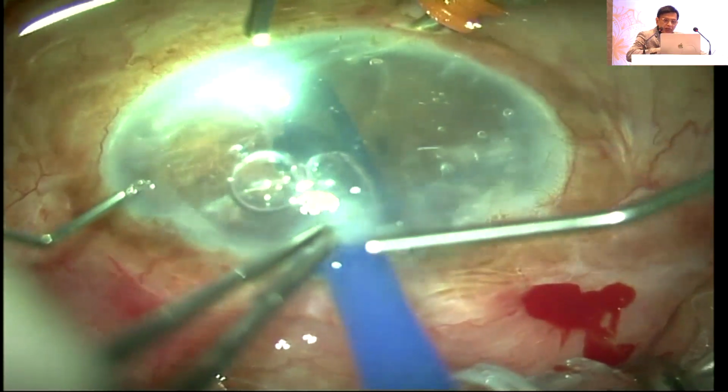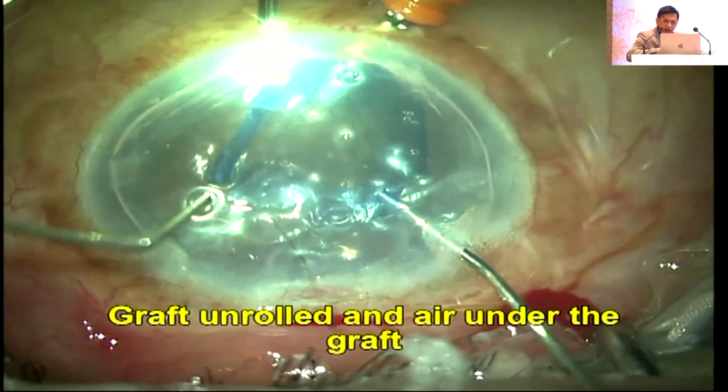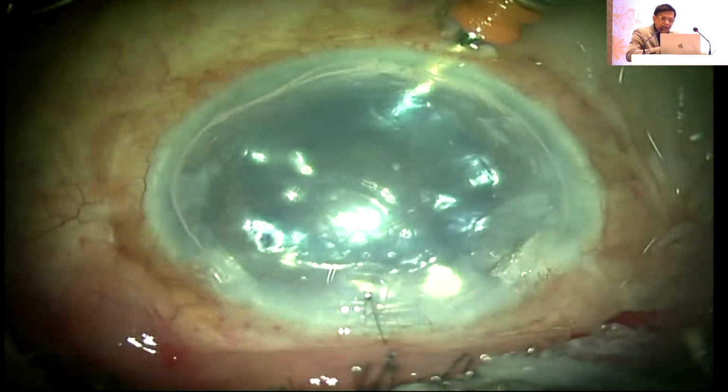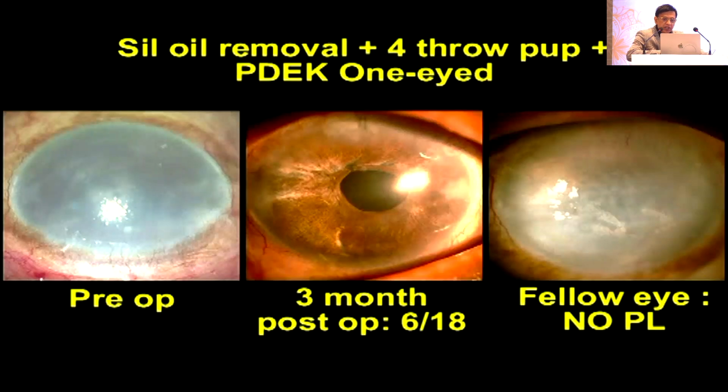So here you see, after I've done the 4-throw pupiloplasty, I've injected the graft. All you need to do is, you can see the trocar AC maintainer, I've got air infusion continuously. Look at the same patient, pre-op, post-op 3 months, 6/18, and you can see the fellow eye was no PL. So now let's move on to other cases also, which I thought I'll show you.